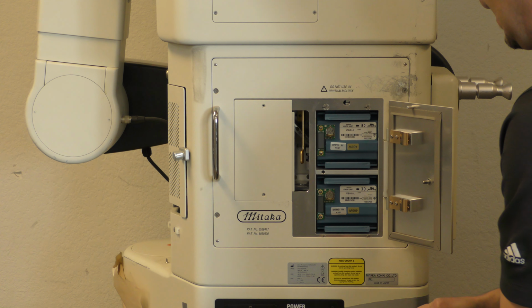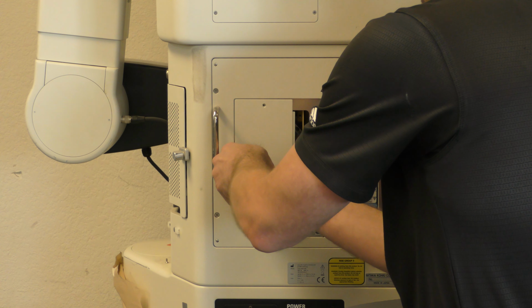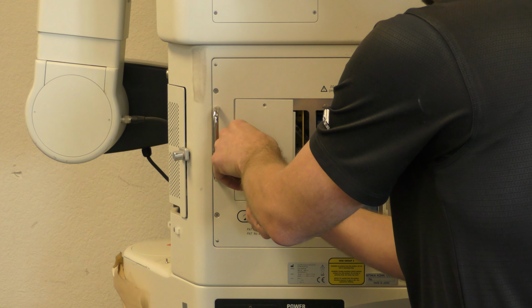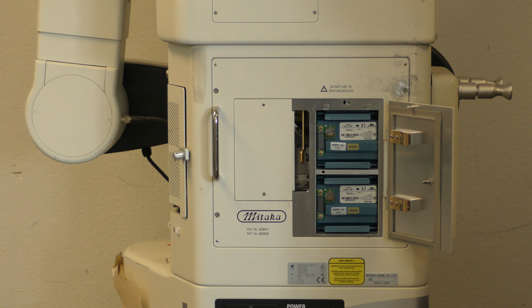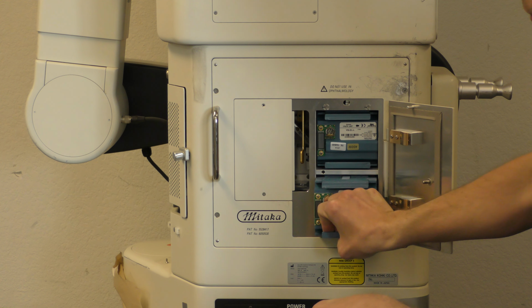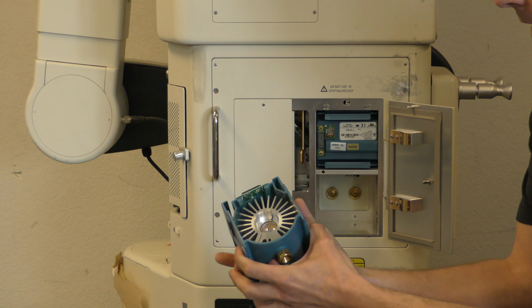So this is the Leica stands. It's very important that your customers understand, and this goes across the board for all microscopes, but the Leica microscopes are unique because the power supplies for the lamps die consistently. If you haven't already changed one out, you're going to change one out. And the reason that happens is these bulbs are rated for 500 hours. But they'll run 2,000 hours. It's not like a halogen bulb.